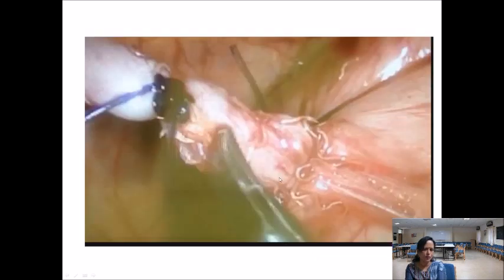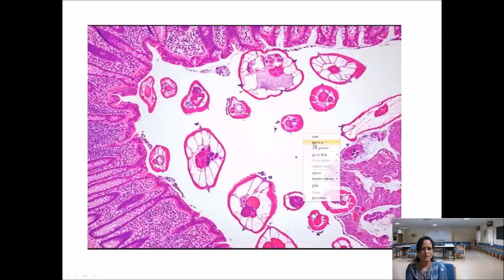They have two thorn-like spikes, projections. All of them have. And this is a female. Why? Because it has got something. So, what did I tell you about the causes for obstruction? Parasite. So these are all cross sections of Enterobius vermicularis.